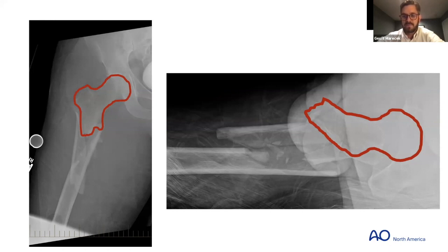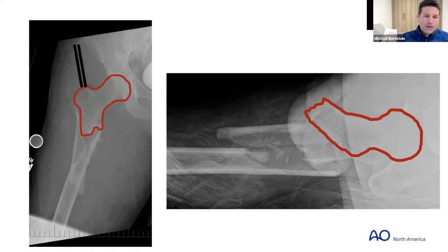Okay. And then I want you guys to think about entry points. So trochanteric starts, whether you're going to use lateral to the troch, tip of the troch, and like Jeff just mentioned, what trajectory are you going to use in that segment? Are you going to do just medial to the tip of the trochanter, or are you looking at more of an anatomic piriformis start to realign with the isthmus?